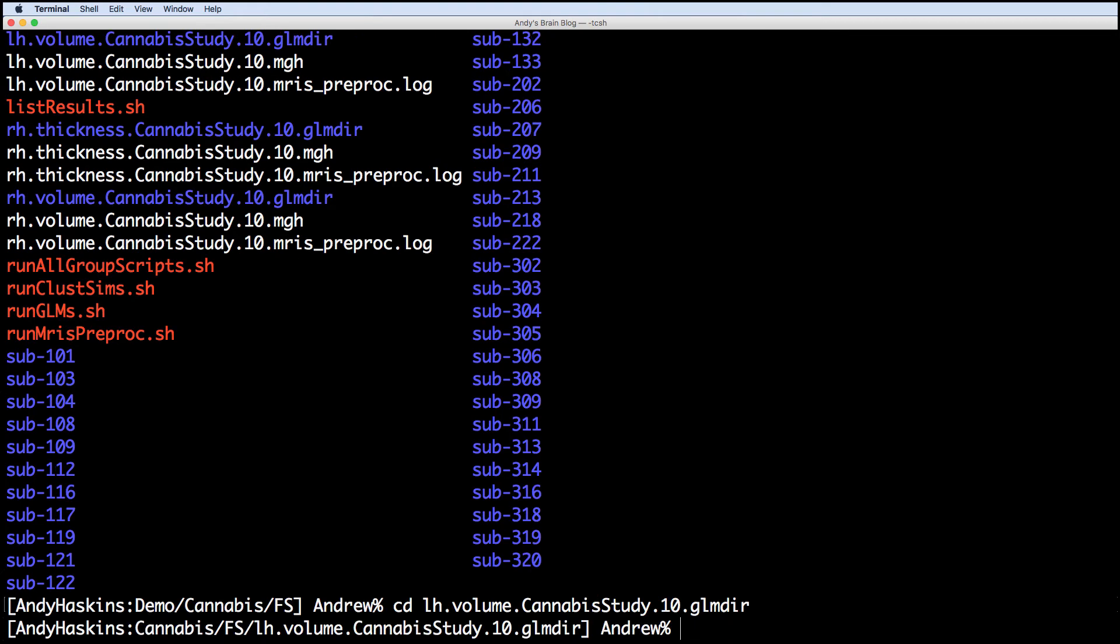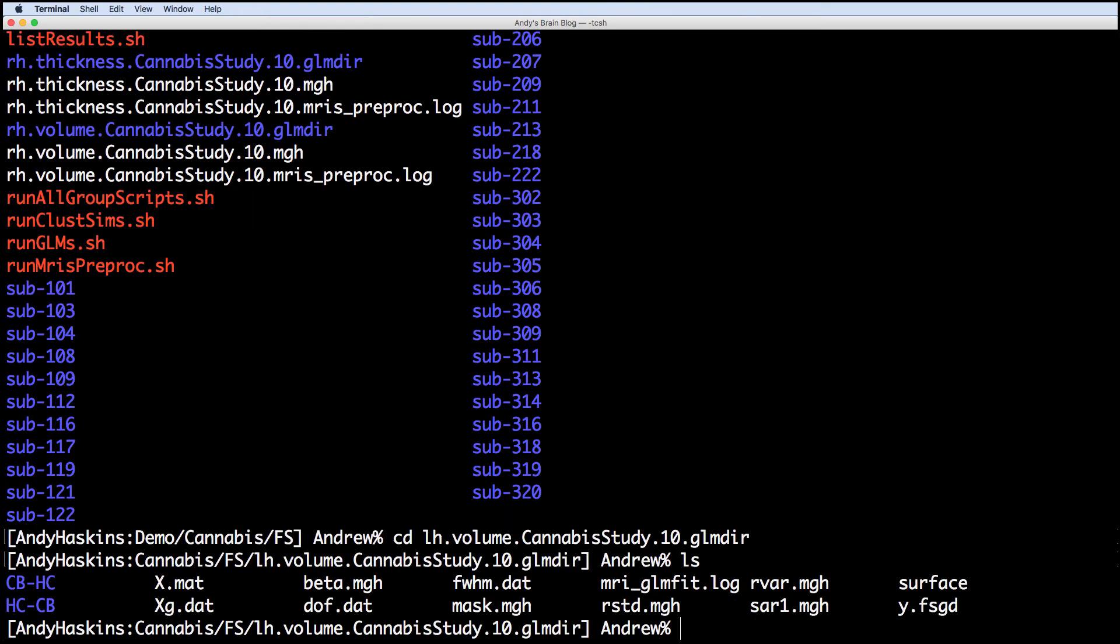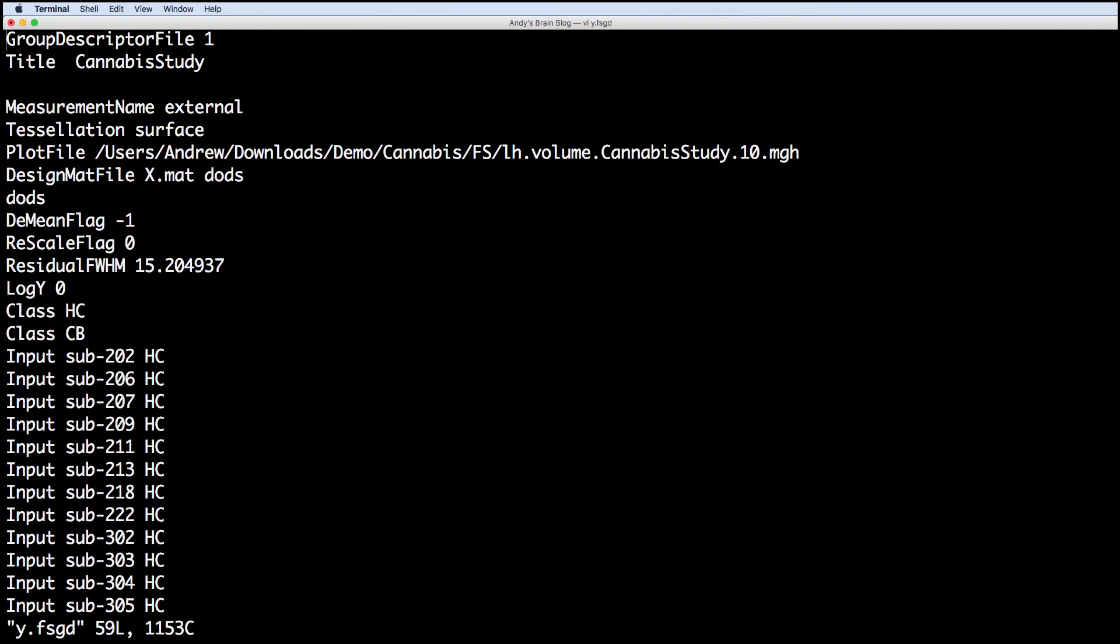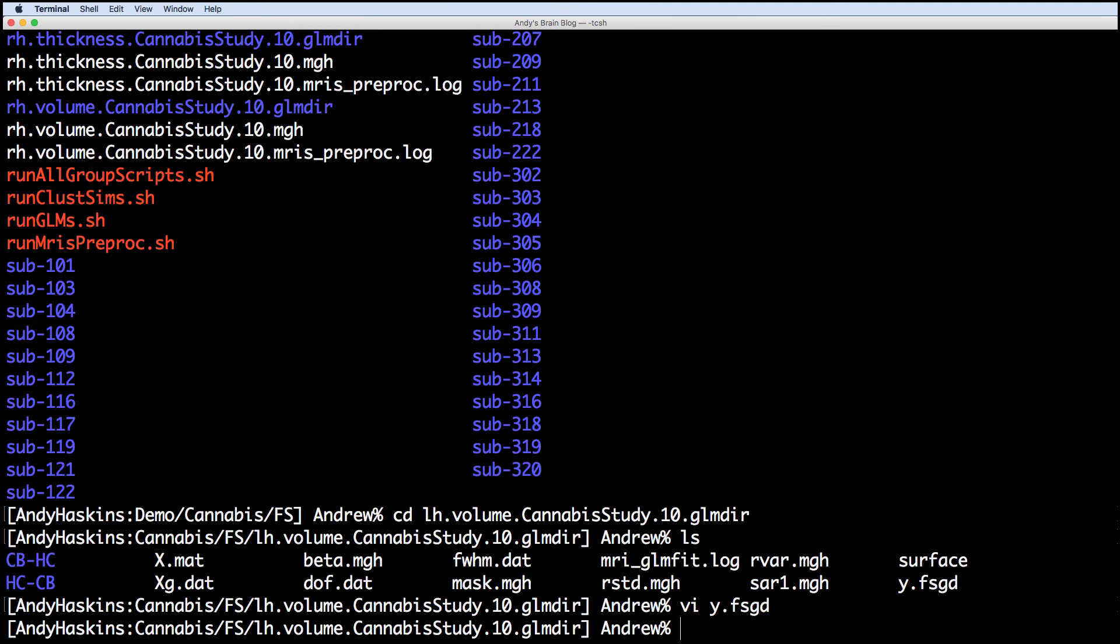There are two sub-directories, one for each contrast we specified. The y.fsgd contains our FSGD file, beta.mgh contains the parameter estimates from the model. See if you can figure out what the other files contain.